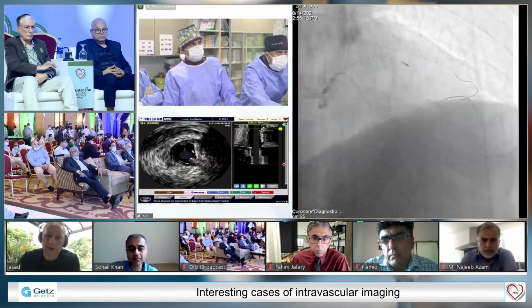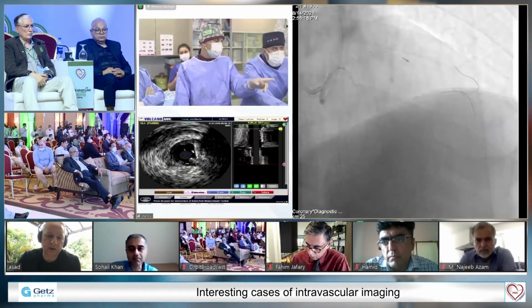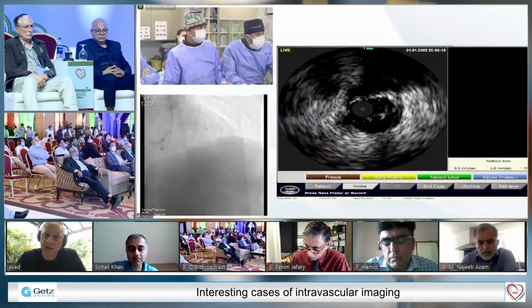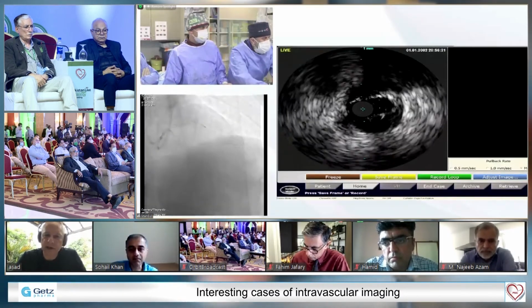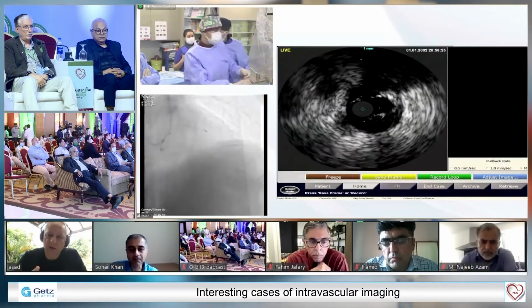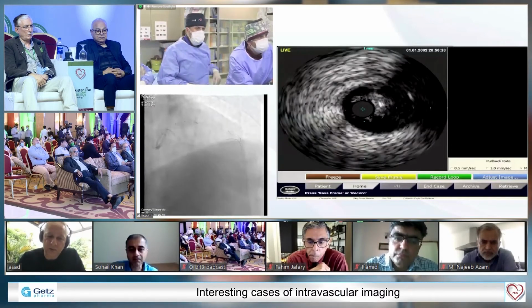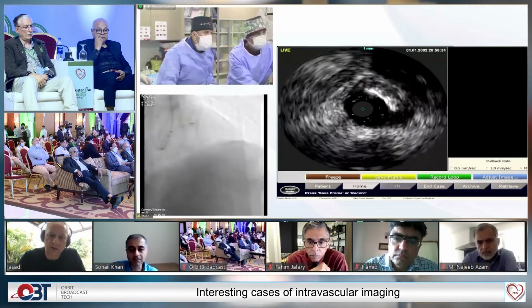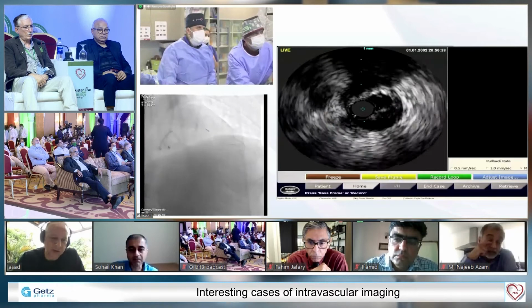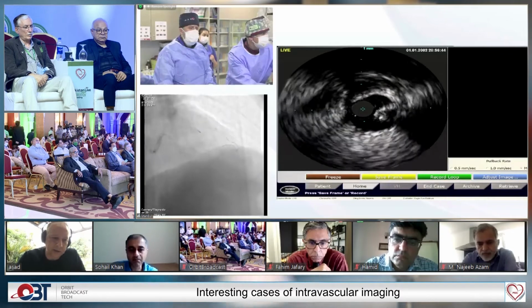I think a couple of points for the beginners. He confirmed that his retrograde wire was intraluminal before he crossed the left main. If you don't do that, you can go subintimal in the left main and shut it off. That can be very high risk. Another option at that time is guideliner-based re-entry. Also, if you're using epicardial collaterals from the left and you use the same guide, there can be a lot of tension on the whole heart, and you can cause ischemia and pressure injury. That's why he switched at this point to a second guide and used the ping pong guide technique.